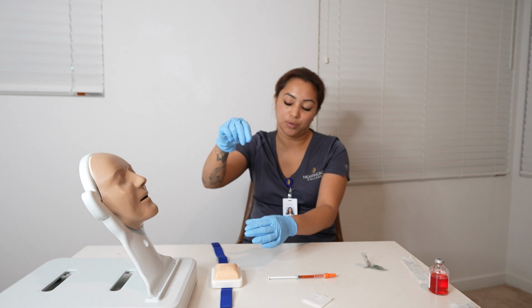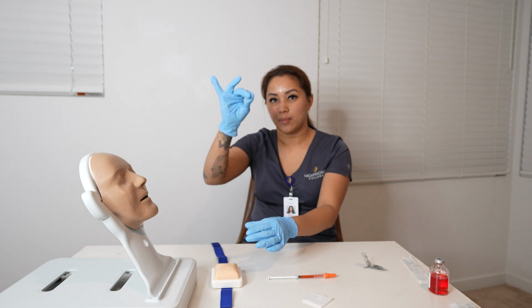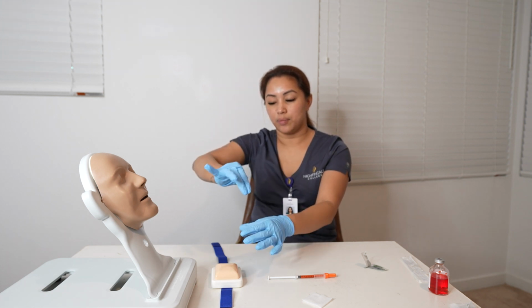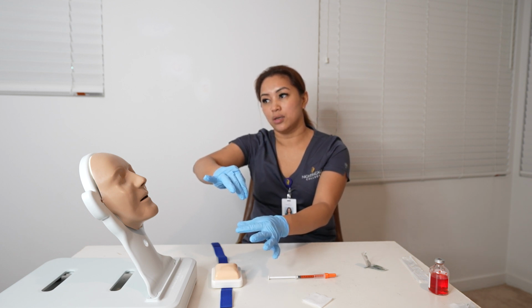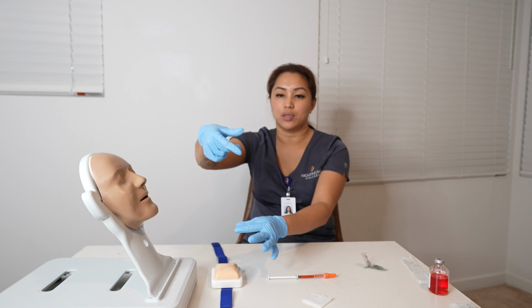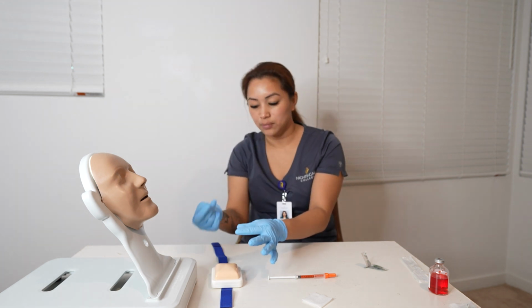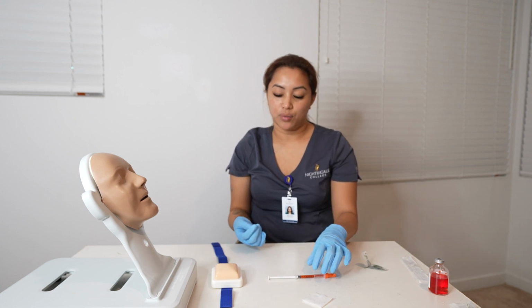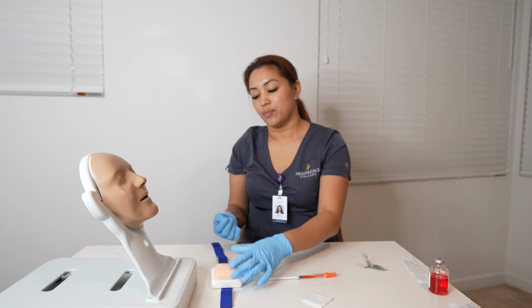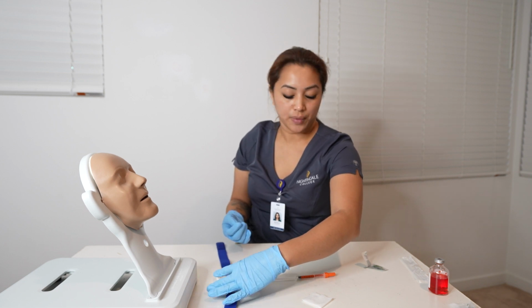I will go 90-degree angle while I'm grasping the skin, and then I'm going to put my palm down like this, and while it is in, with my non-dominant hand, I'm going to stabilize the syringe barrel with my thumb and my finger. Now I'm going to inject the heparin into the belly. All right, now that it is air dry, I am going to make sure that I grasp it like this, like so.